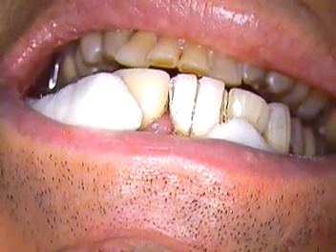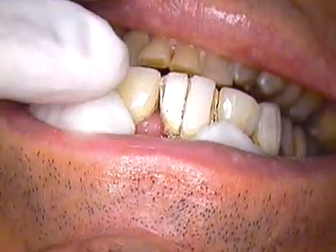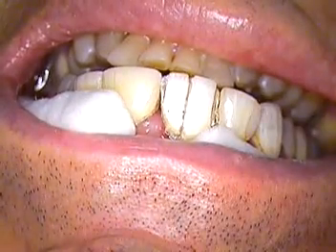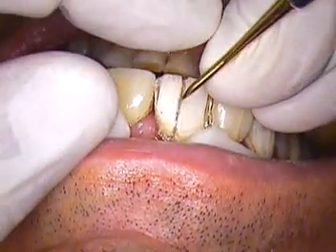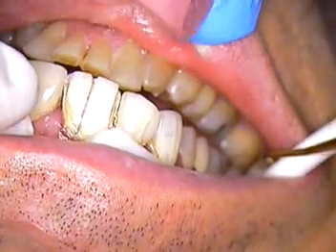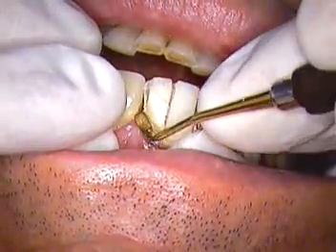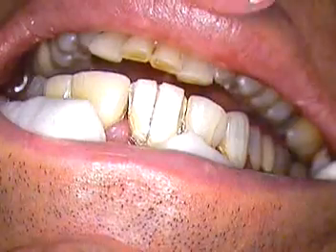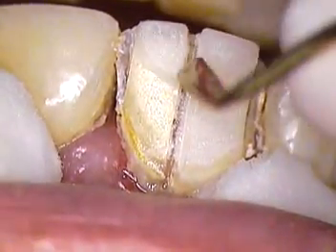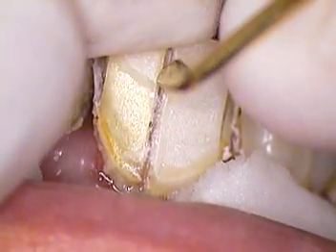Now we'll use a flat end instrument. We're going to see if we can just pop this off here. Possibly pop that off. All right, we'll give it a try. There goes a little piece down that side there. Open up also here. Okay, close again, Troy. Yep, so it's separated away from the cement. And look at that cement. It's got a lot of little reflectiveness to it. Kind of neat. Try it again.